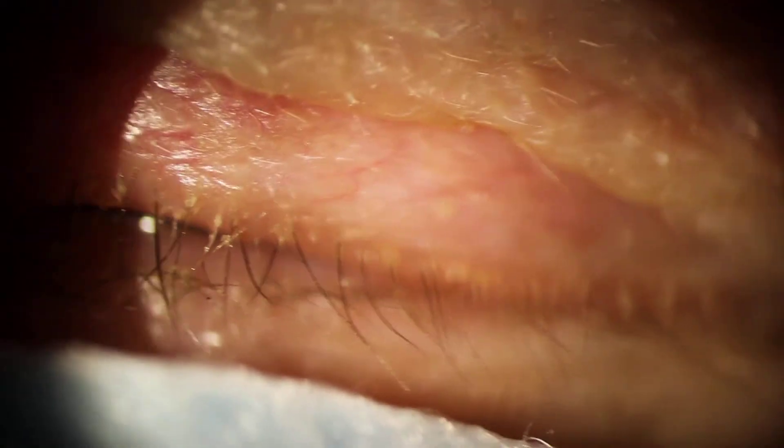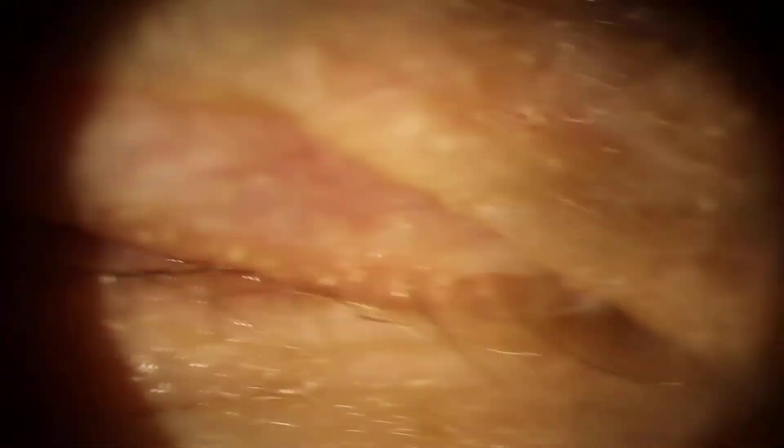Should I put it? Yeah. It's coming up to your eyeball. We'll pull it down just a little bit. There you go. Perfect. And we can hold there for a second. Good. Do you hear it?